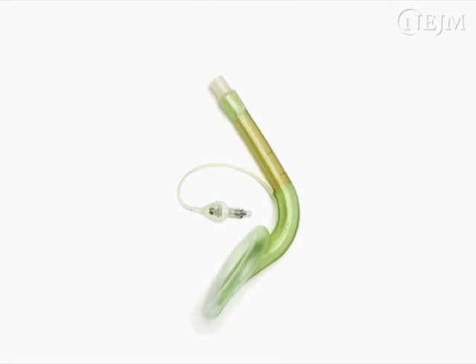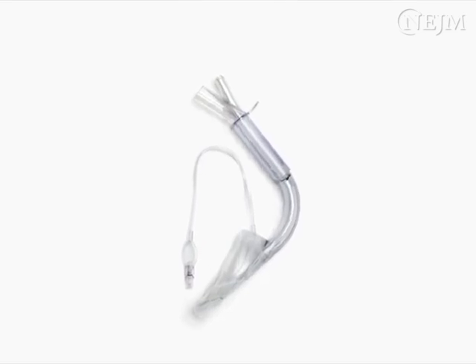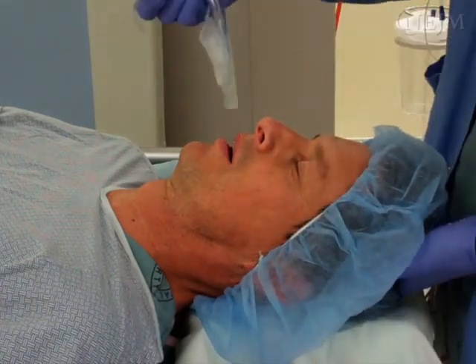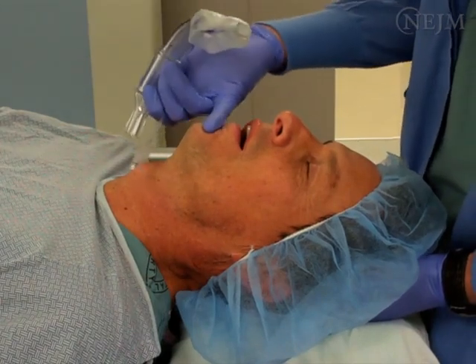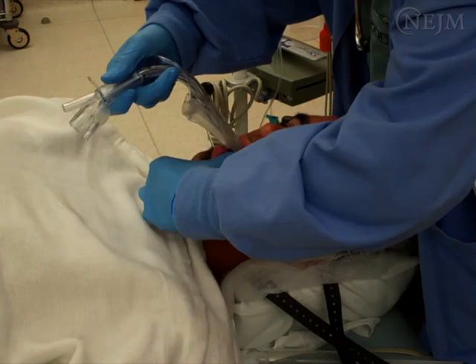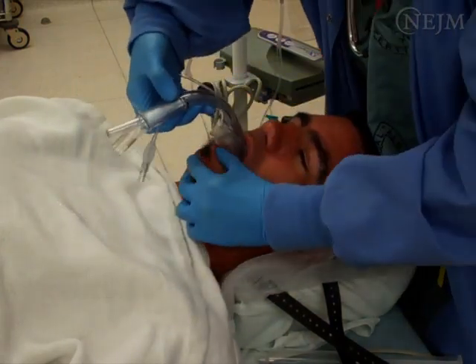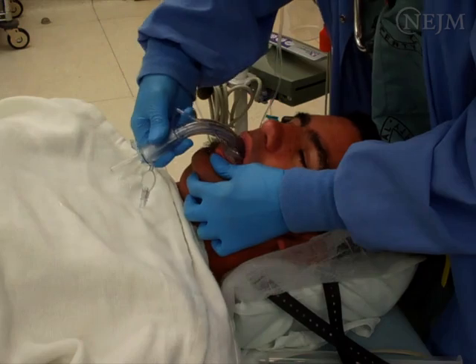Use of a pre-curved laryngeal mask airway sometimes allows placement without the need to insert hands inside a patient's mouth. To place a pre-curved laryngeal mask airway, grab the connecting tube with your dominant hand so the cuff points to the patient's head. Your hand should be in a neutral position with the thumb on the upward surface of the tube. As with the straight tube, guide the laryngeal mask airway above and behind the tongue by applying firm pressure along the patient's hard palate.